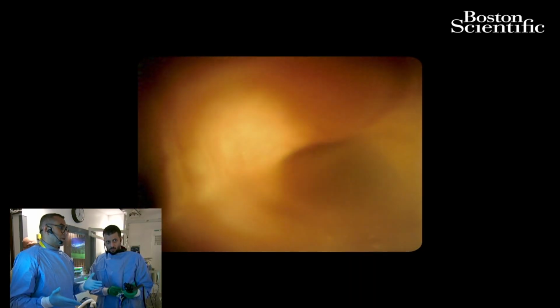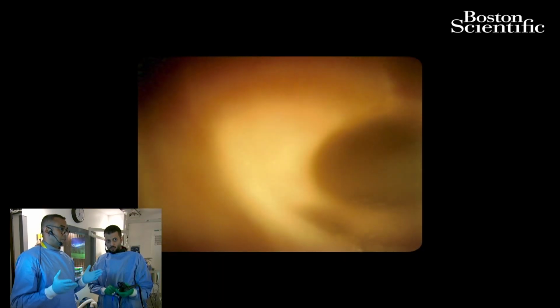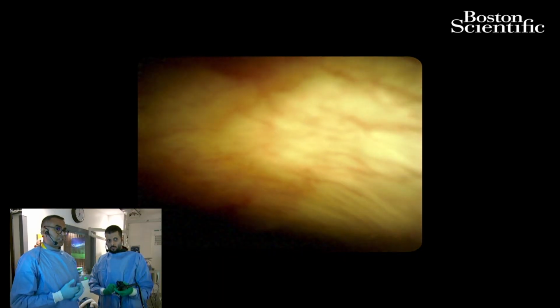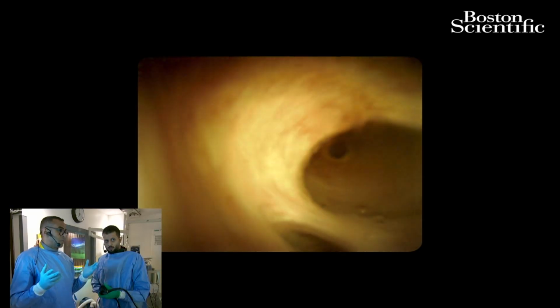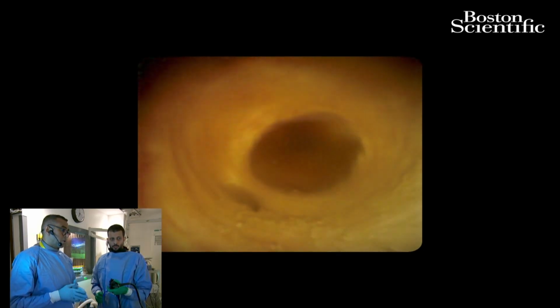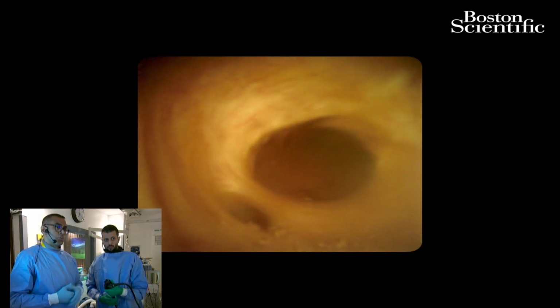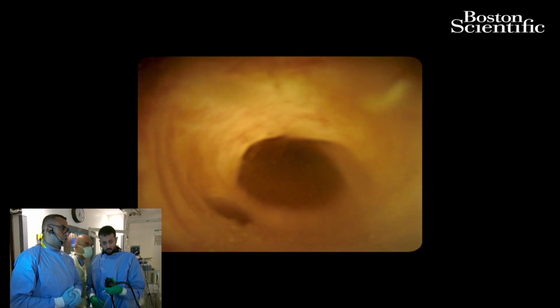I did the ERCP as an index procedure, and you know what? We called it off on the first session. We said, this is a post-cholecystectomy stricture, and there is nothing more to be done about it. So I agree, it could be anything. Collecting and obtaining a good history is very important because that would favor one thing over the other. But when it comes to diagnosis, we need to do something.